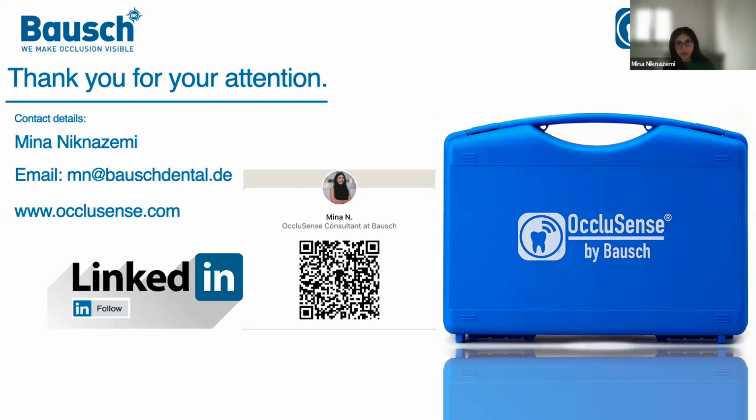It's a very good question. You can use the same sensor on the same patient multiple times. The color coding has been developed in a way whereby we've conducted 12 measurements with one sensor on the same patient. Obviously, it's not sterilizable because it's an electronic device. The sensor has electronic pixels in it, so we can't sterilize it. Therefore, it's not usable on other patients, but the same sensor can certainly be used multiple times on the same patient.